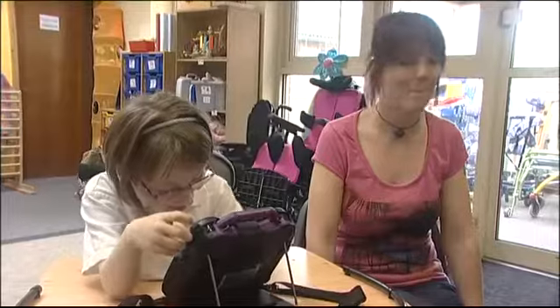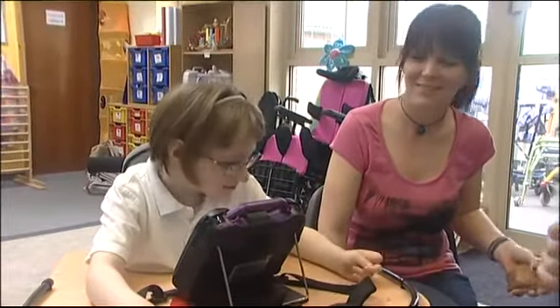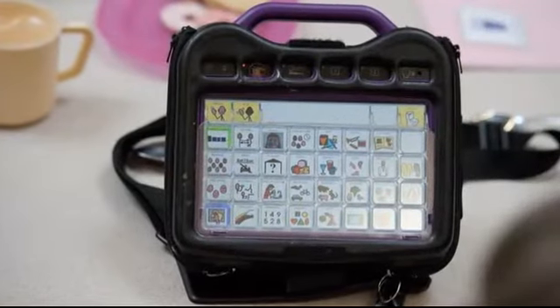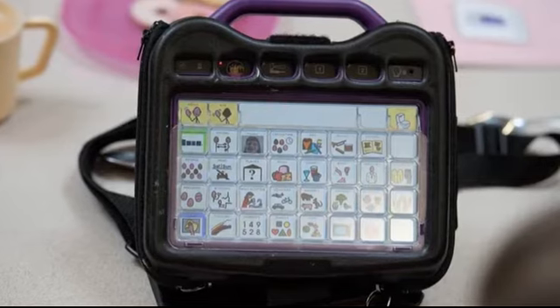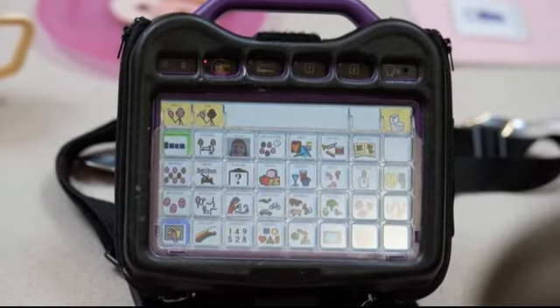Well done. Hayley also has a physical disability which affects her movement, although she is able to make some sounds and she's able to vocalise yes. She uses a springboard light communication aid using her hands. She uses a key guard because she's got significant tremor, and it means that she's only able then to hit one cell at a time. And the screen is also calibrated so it has a slight delay, so that even if she presses it twice, it will only speak once.